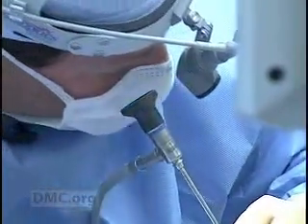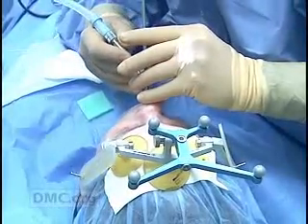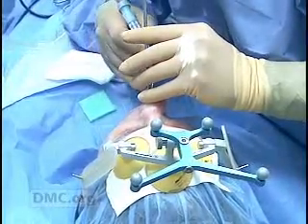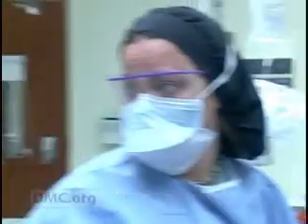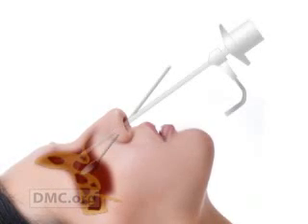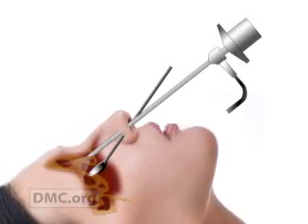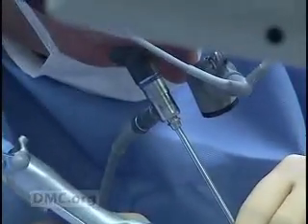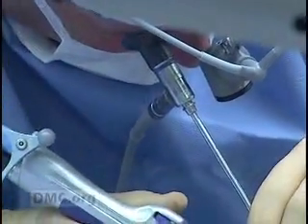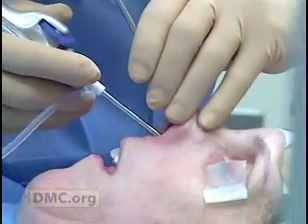Then, to actually perform this delicate and complex surgery, the doctor employs a revolutionary image-guided system that gives him precise and highly detailed 3D images. The images help to guide his instrument with a tiny blade on the end through the twisting nasal passages deep into the blocked sinus cavities. Then, he uses the instrument to trim and suction away both tissue and bone with great precision.